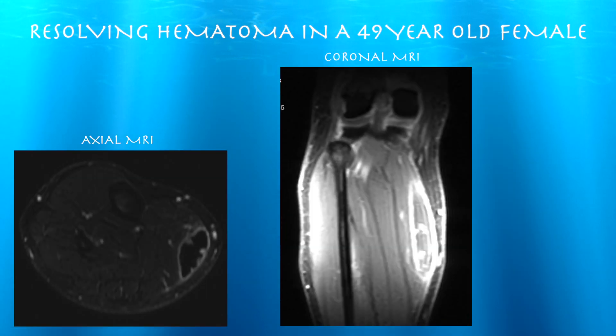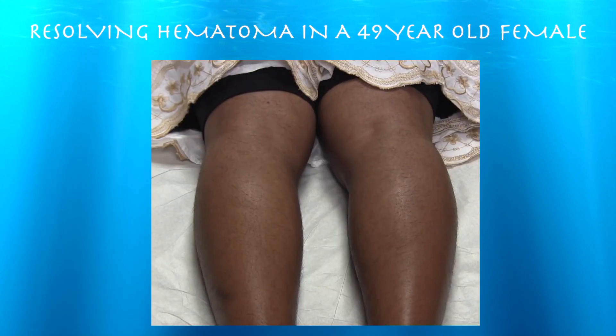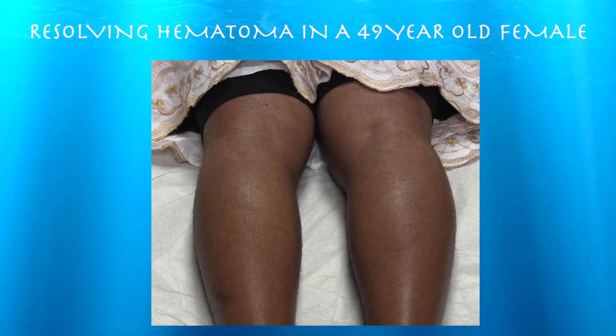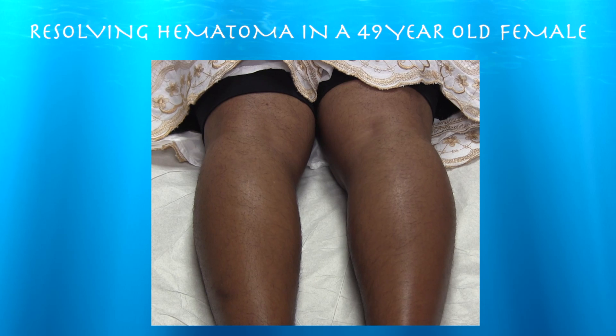Here's an axial coronal MRI showing this very sizable mass within the medial gastrocnemius muscle. We're going to do a follow-up ultrasound. This is about a year — almost a year and a half — after I initially saw her.